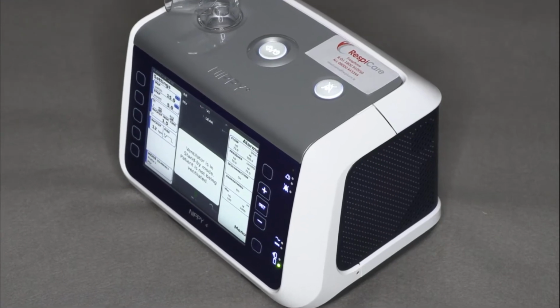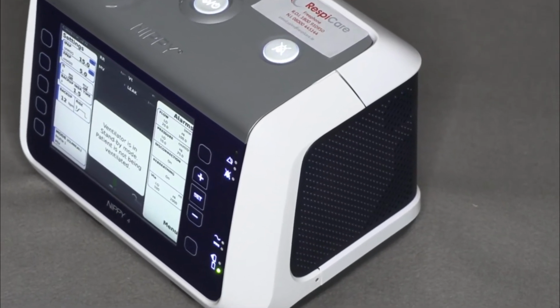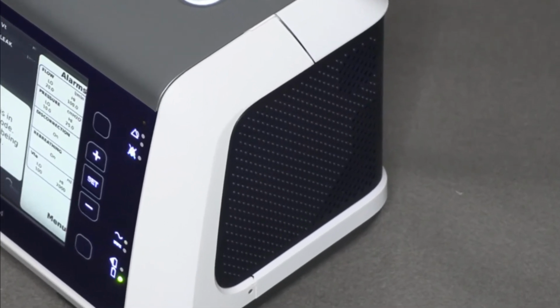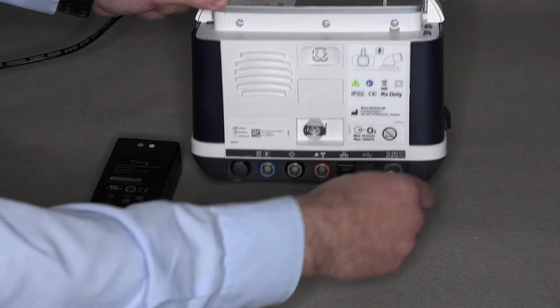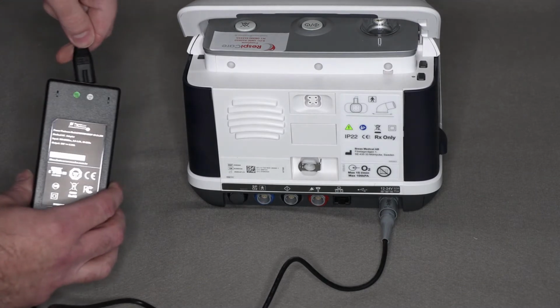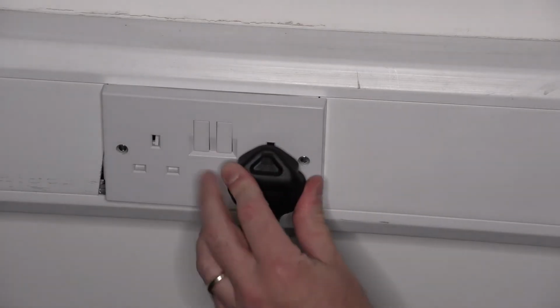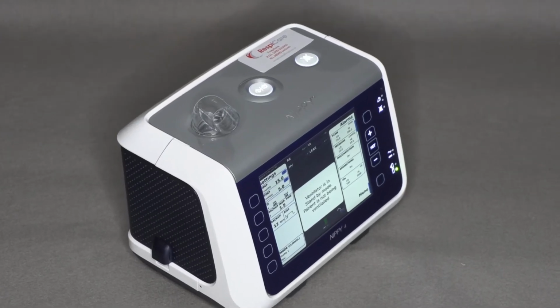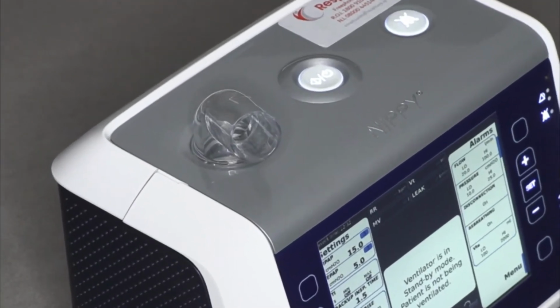At the right hand side of Nippy 4 you will see some holes. This is where the ventilator will draw in room air through some filters which are behind this door. The power supply cable can be connected to the power connection at the rear of the device, and the mains power cord can then be connected to the power box and plugged into the wall socket. At the top of Nippy 4 you'll see the outlet port where the breathing tube will be attached.